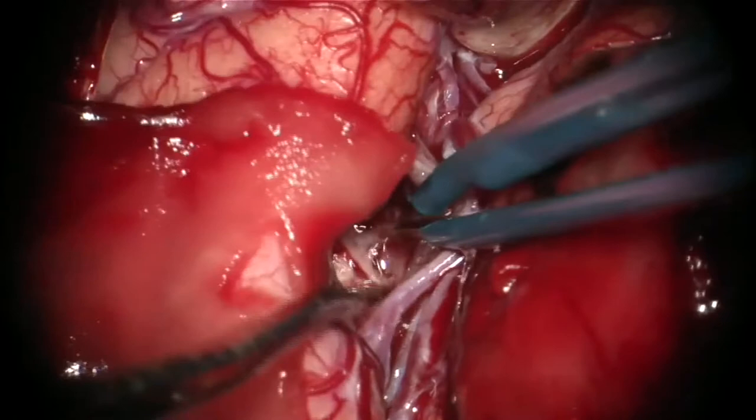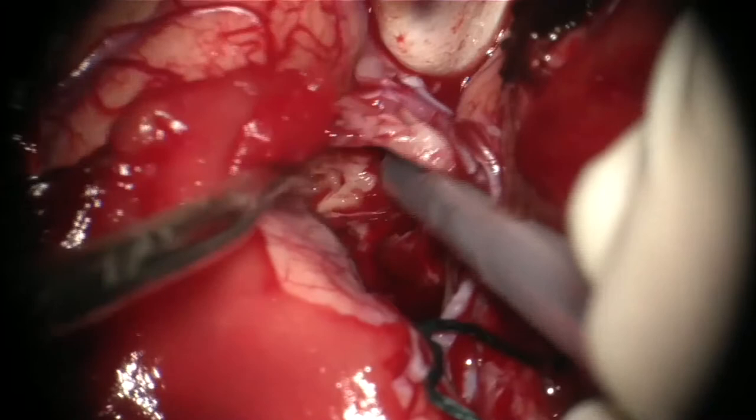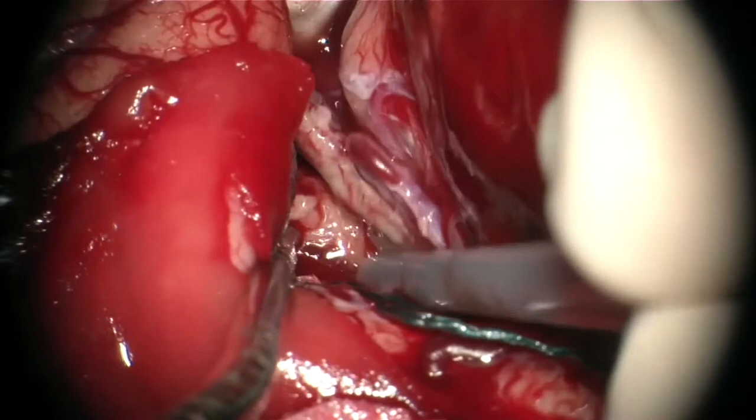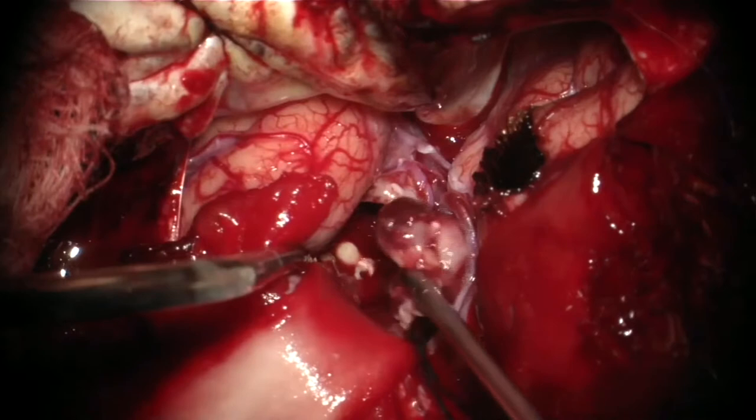I start now identifying the tumor surface. I start getting a lateral plane of dissection where I can see the white matter and work my way anteriorly until I find the pia superiorly of the sylvian fissure. Coagulating the tumor and getting some of the pieces of the tumor for pathology.